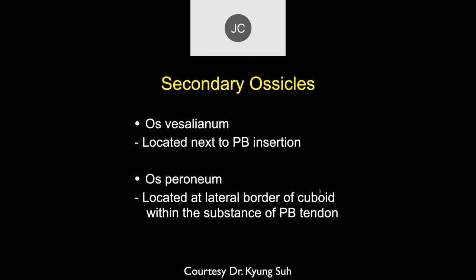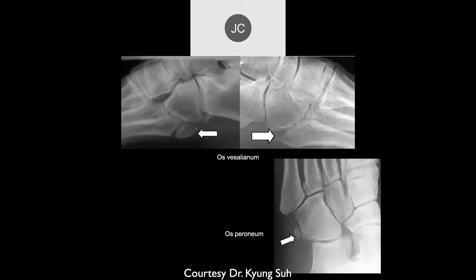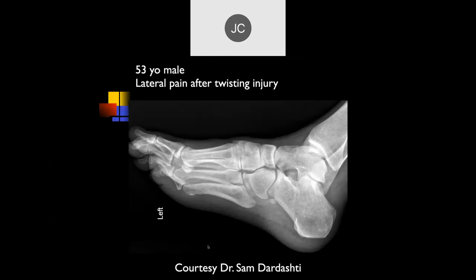There are a bunch of secondary ossicles in this area with variations in size and shape. In many publications these are thought to be congenital variants, but I think the vast majority are actually acquired conditions — and I agree with that.